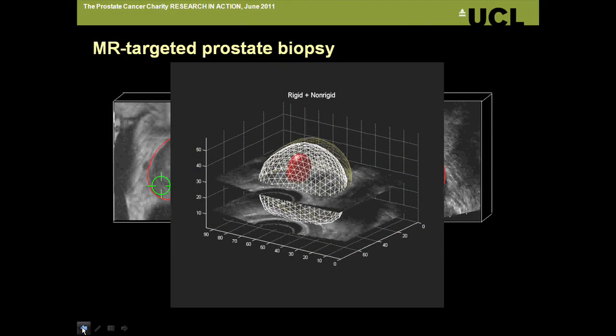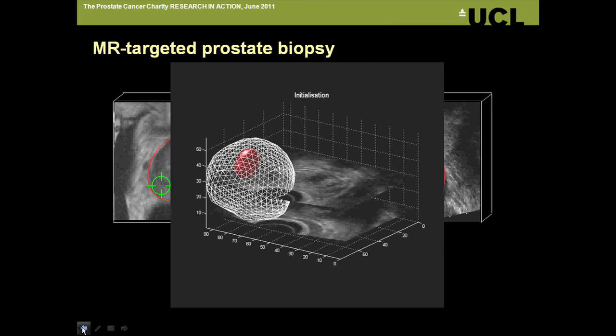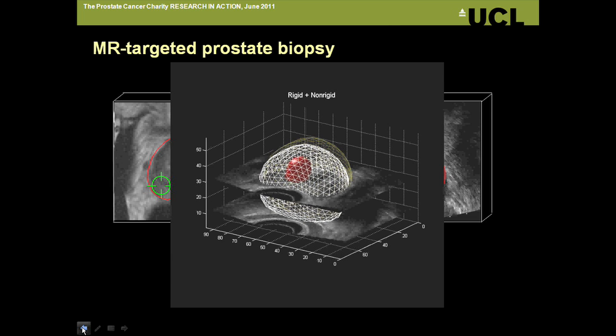So one of the technologies that we'll be invoking in this project to be able to do that is a method which is quite involved and sophisticated in computing terms that allows us to take information from an MR image, i.e. where a tumour is, and translate that onto the ultrasound images that we obtain using our biopsy system. And this is an animation of that in action from some previous work that we've done in the context of prostate cancer therapies. And you can see this 3D model, which has been generated from an MR image of the prostate. The red blob in the middle is a tumour, and this is fitting to some ultrasound images so that the two are well aligned. And once they're aligned, we can actually go in and target that tumour, hopefully accurately.